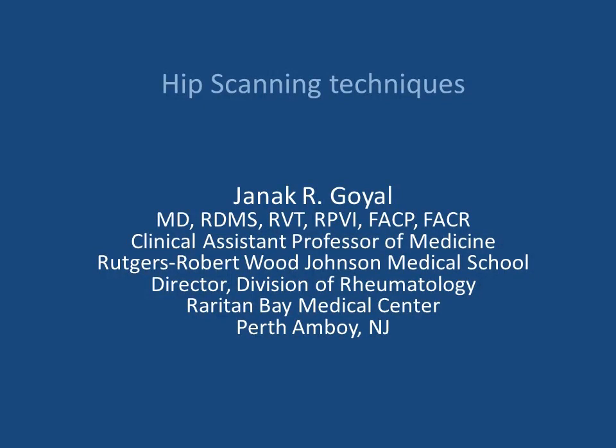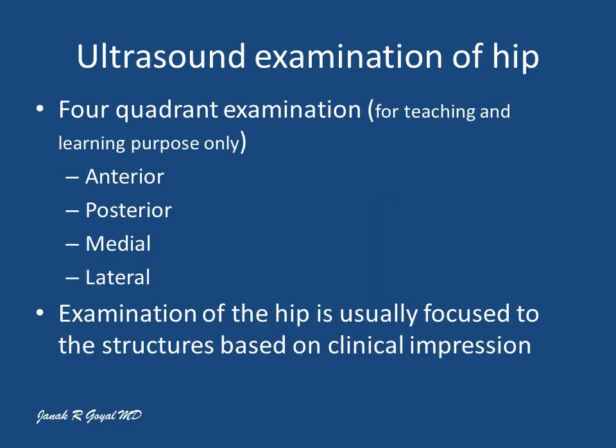Welcome. Let's talk about the sonographic examination of the hip. The sonographic examination of the hip is conducted in 4 different quadrants: anterior, posterior, medial, and lateral.